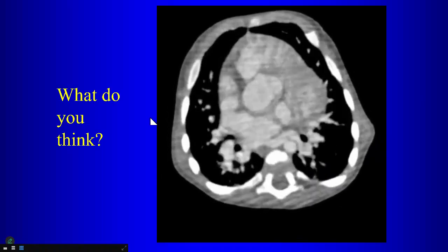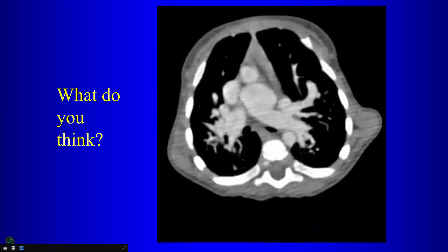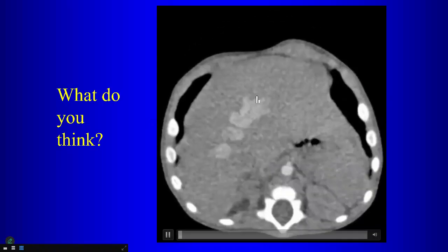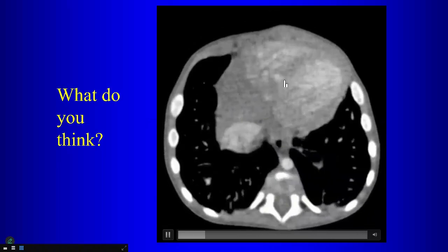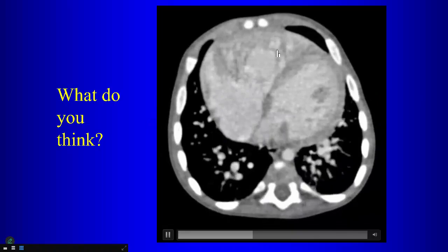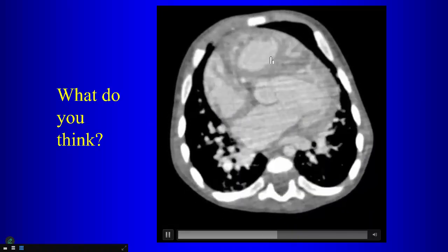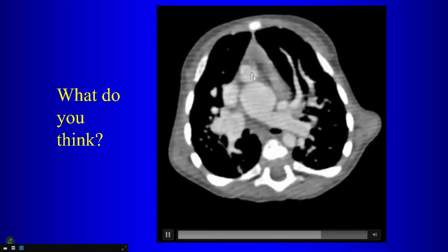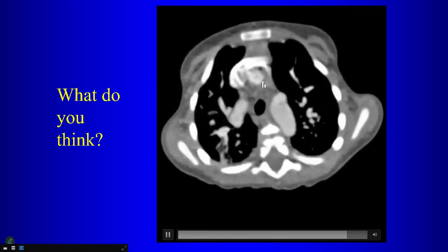So that's connecting to the aorta. Yeah, so this guy here, it turns out, is the aorta. You can identify the aortic arch there, okay? So the right ventricle, as we follow it up, will connect to the aorta. So you can see there's the aortic arch.